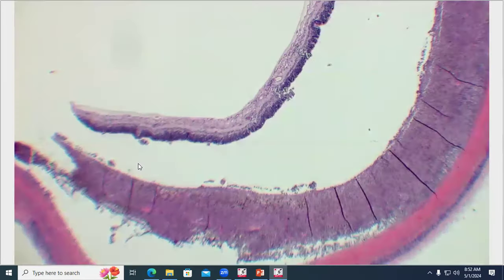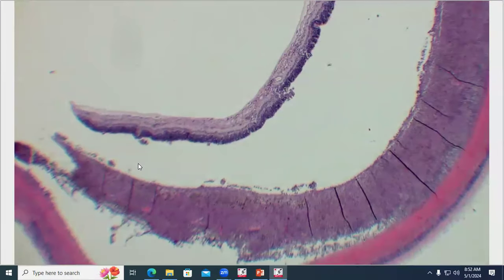So, bilateral enucleation, a dog with a histiocytic panuveitis that has lots of melanin-laden macrophages and free melanin in the background, retinal detachment, and a uveocentric sort of process, and a very symmetrical disease. These are all classic features of uveodermatologic syndrome or VKH-like disease.